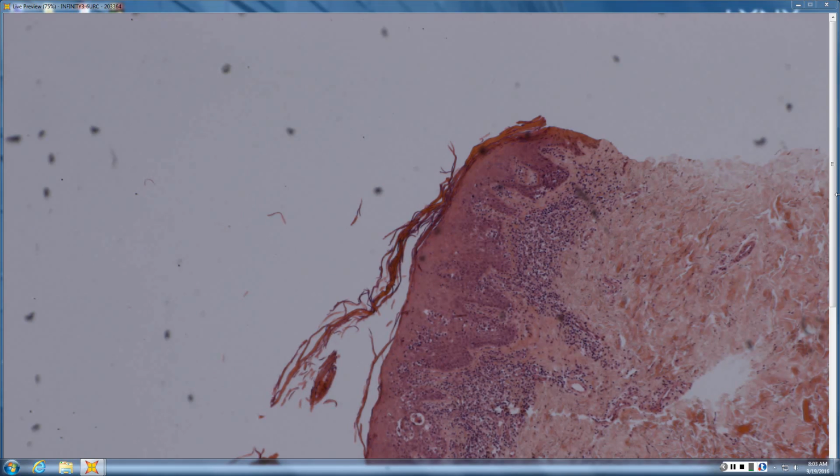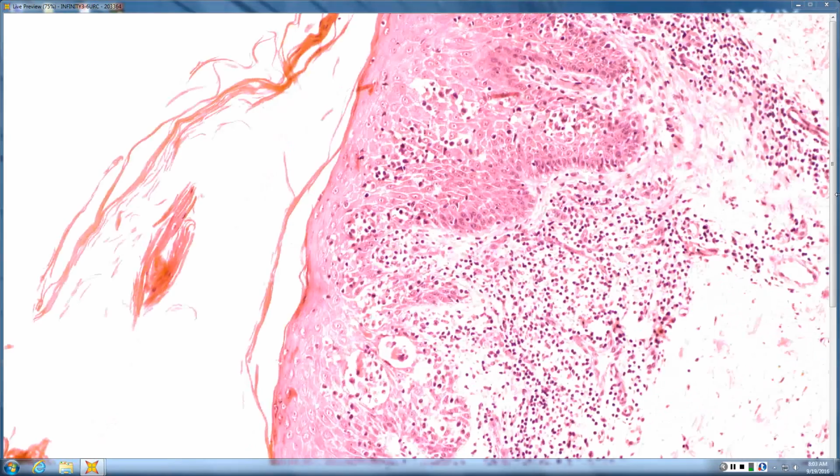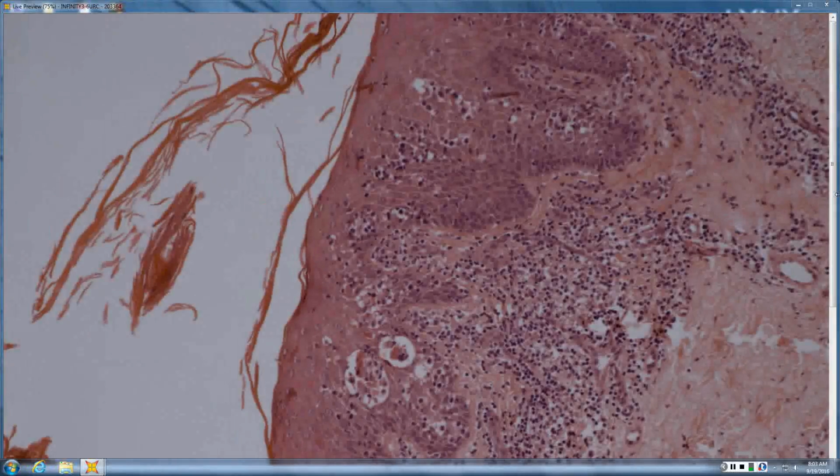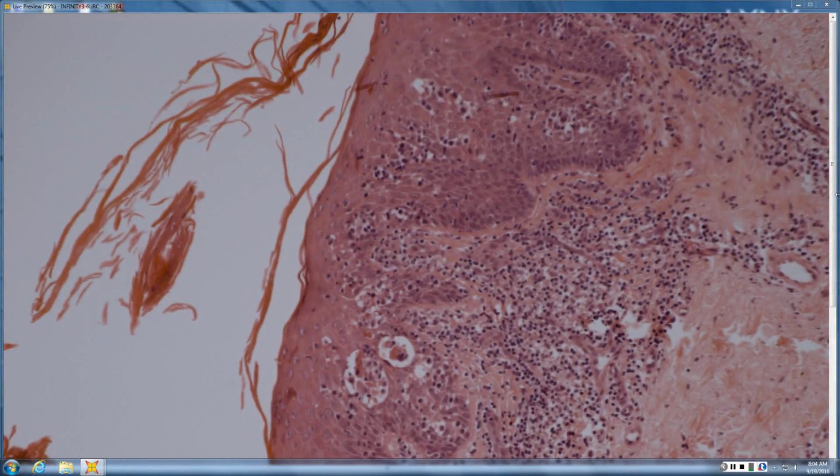I guess your differential for lymph in every hole would be like, you would think about MF. So lymph in every hole is MF, MF, MF. Right. Early evolving benign lichenoid keratosis, pityriasis lichenoides, syphilis, and then sometimes drug. Right. So, when I look here, I don't see any red cell extravasation. I agree, no red cell extravasation.